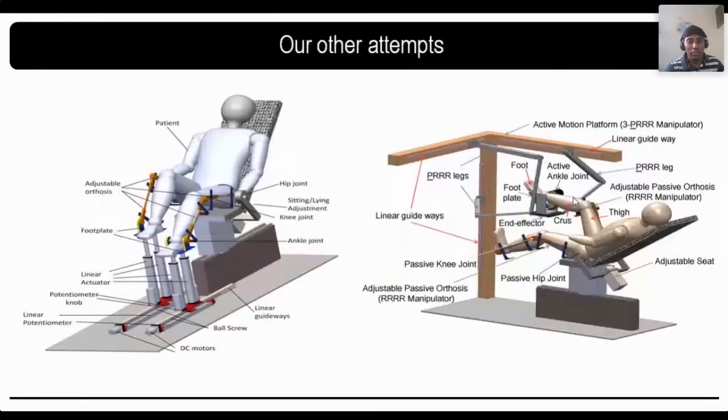Apart from that, we have come up with several other attempts. One of the popular attempts is called Ankur-1. Ankur means a baby plant. This can be used for both sit and stand cases. It can be used simply as a stationary trainer, and later it can be elevated and used for gait training. This is mainly for all kinds of therapeutic treatment. In fact, this is one of the Russian collaborated projects with my group. So these are our simple attempts.